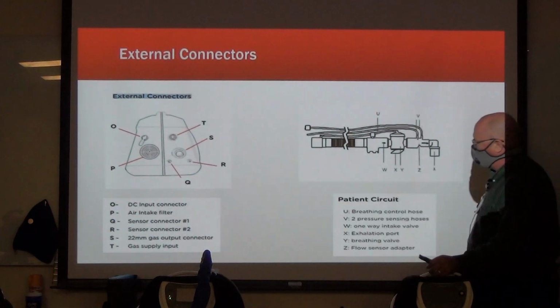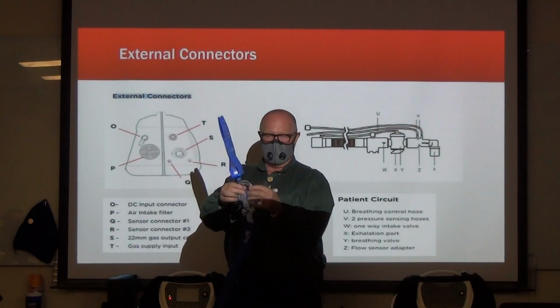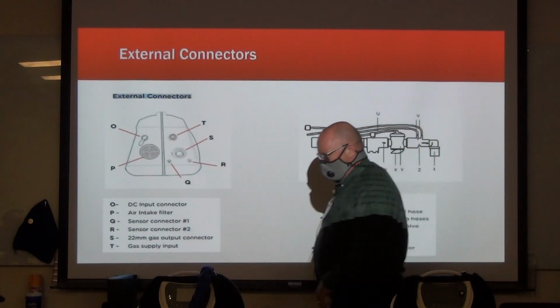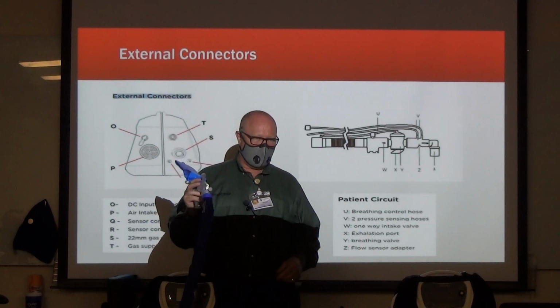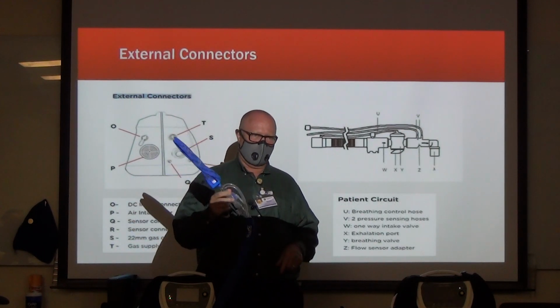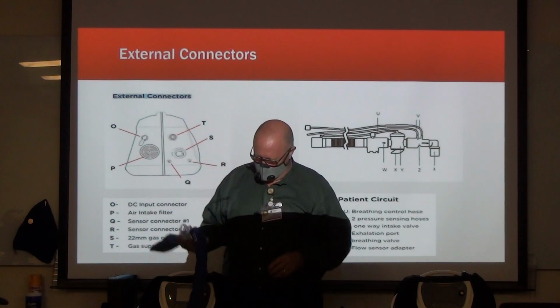It's not very cumbersome. Okay, the next thing is the patient circuit. What's important here is that when you have alarms, one of the things we're always going to look at is: is everything connected? Because that will actually produce different alarms. In fact, yesterday, one of the medics, without me knowing, pulled this one off, put it here, and this one on that one, and it wasn't sensing and wasn't providing breaths. They said, well, it's right here in the same piece of plastic, why isn't it working? I said, switch it back. As soon as they did, it started working. So there's purpose for them being in the right place.